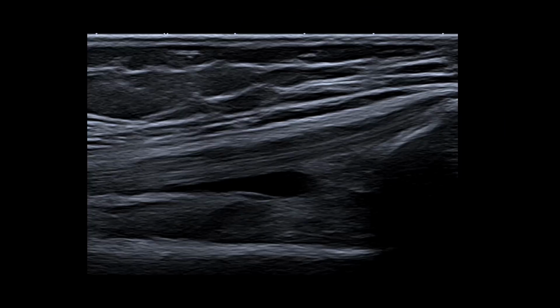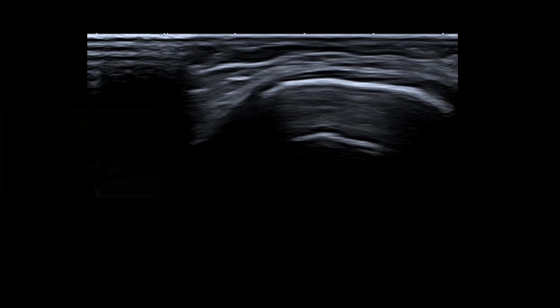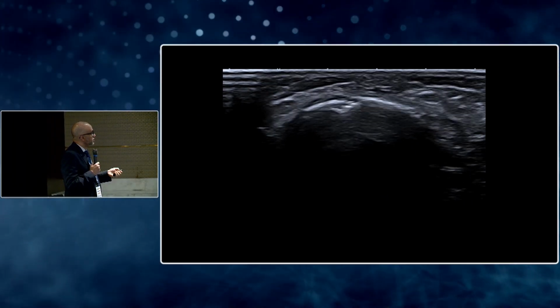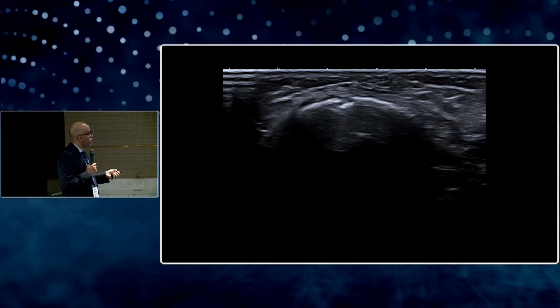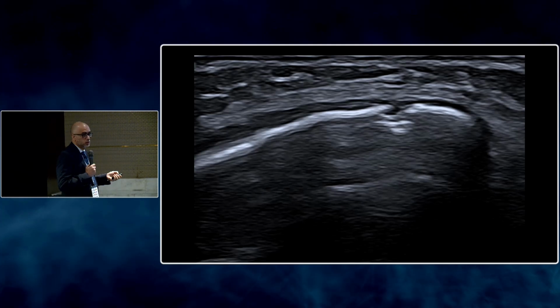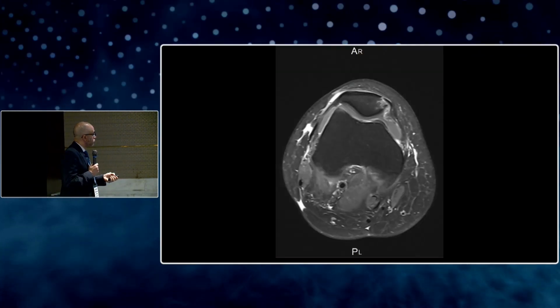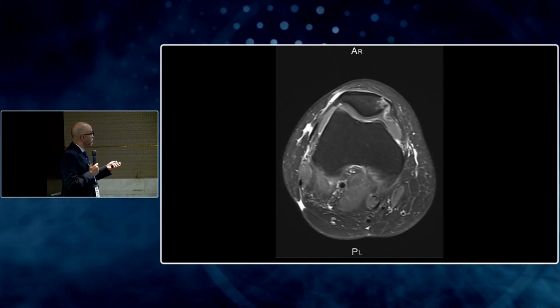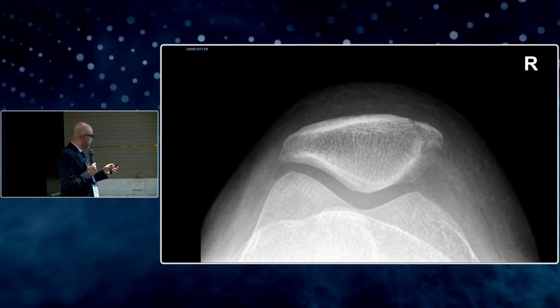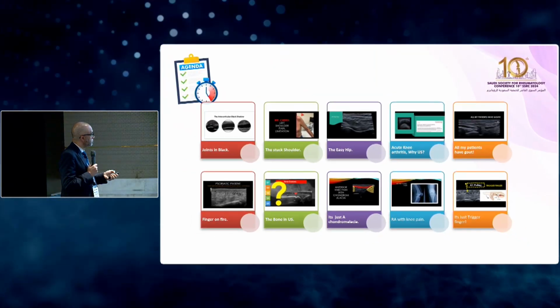This is the knee pain of one of my patients with rheumatoid arthritis, and on examination of the patella, you can see here step-down abnormalities of the cortex of the patella. It's a typical picture of fracture of the patella after a minor trauma. Ultrasound can also diagnose fractures, and this was confirmed by the MRI. It is not seen on the conventional X-ray. And in the follow-up, you can see here the line of the fracture on conventional X-ray.